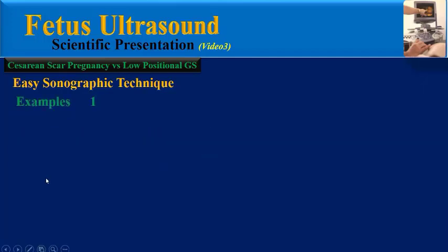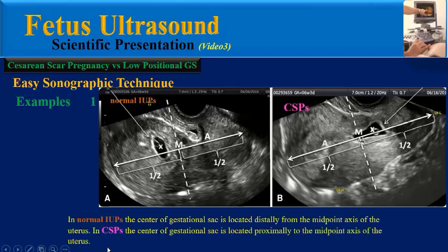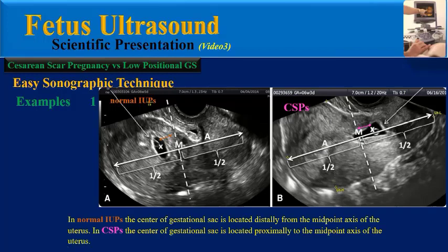Some examples of this technique: this is a normal IUP and this is a CSP. In a normal IUP, the center of the gestational sac is located distally from the midpoint axis of the uterus. But in CSP, the center of the gestational sac is located proximally to the midpoint axis of the uterus.